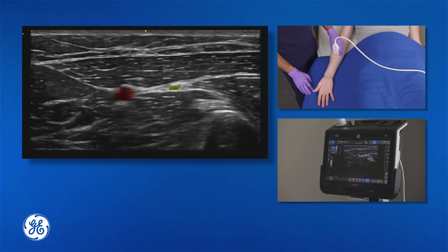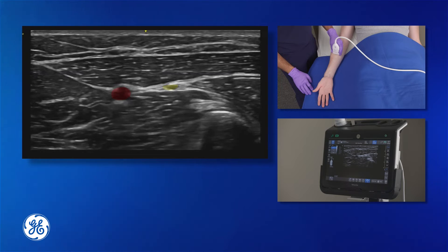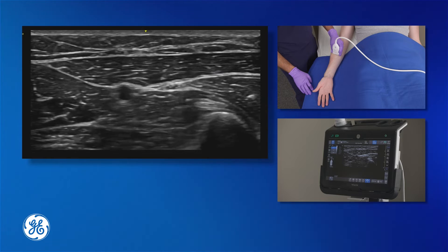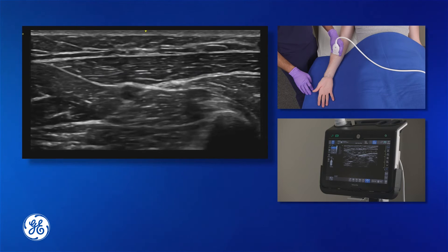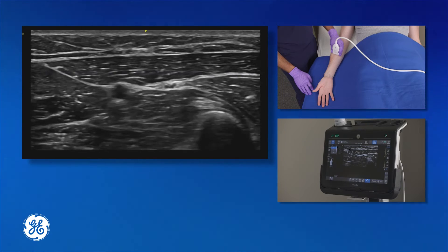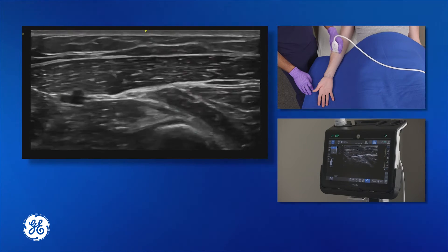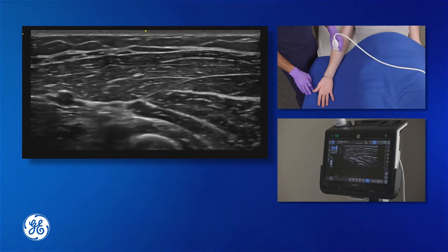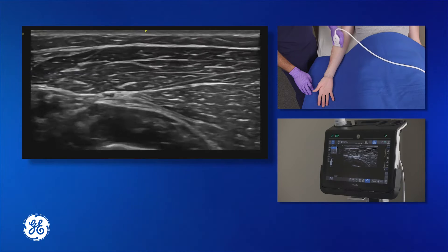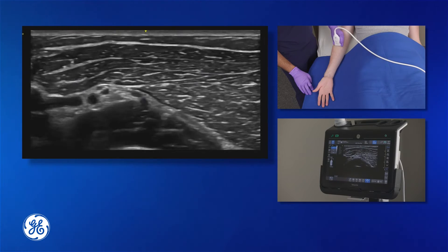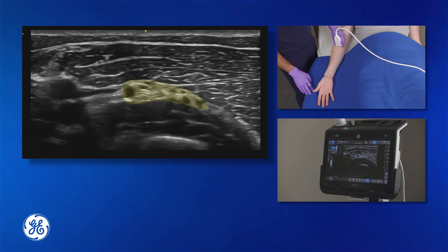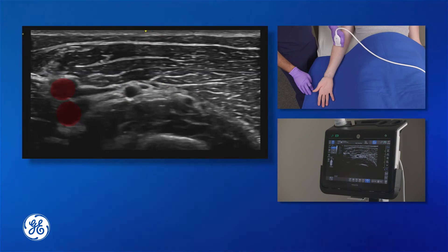We can visualize here that the radial nerve is adjacent to the radial artery, but it's not as easily visualized as it might be more proximally. So I like to carry my scan more proximally, past the mid forearm to near the elbow, to visualize the radial nerve even better. Here you can see an excellent visualization of the radial nerve with the radial artery off to the left of the screen.